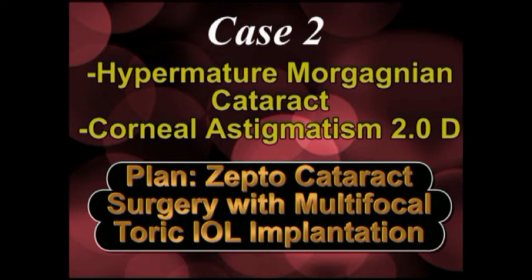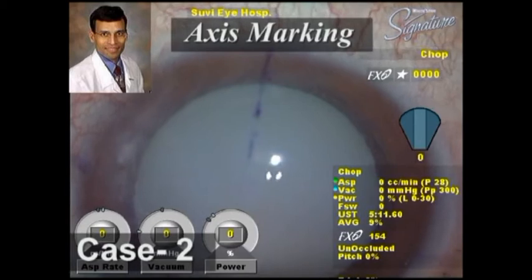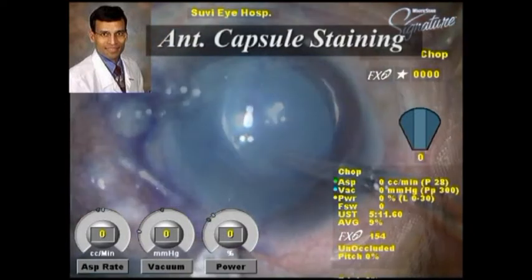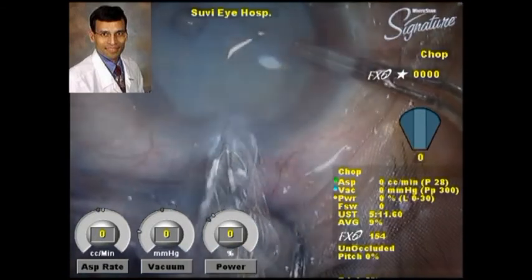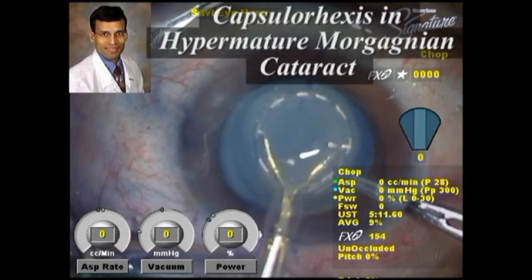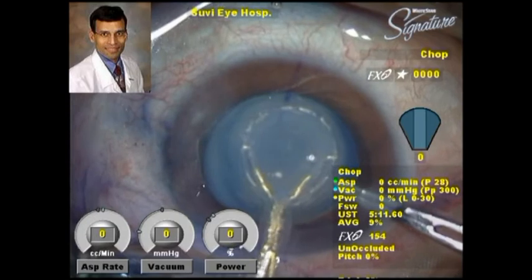This is the second case, a hypermature Morgagnian cataract with corneal astigmatism of two diopters, and again we plan a Zepto cataract surgery with multifocal toric IOL implantation. In this kind of Morgagnian cataract, the capsulorrhexis is an extremely difficult step. There is a corneal scar from a previous pterygium surgery, which is probably causing the corneal cylinder. We give the sideport incision, mark the axis, and inject dye into the anterior chamber. The silicon suction cup allows good visualization, and the cup is centered using the push-rod mechanism on the visual axis under direct visualization. Very brief low-energy pulses are then directed through the nitinol ring to create the capsulotomy.